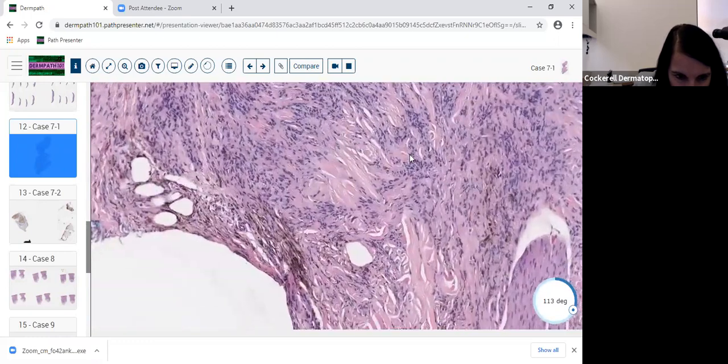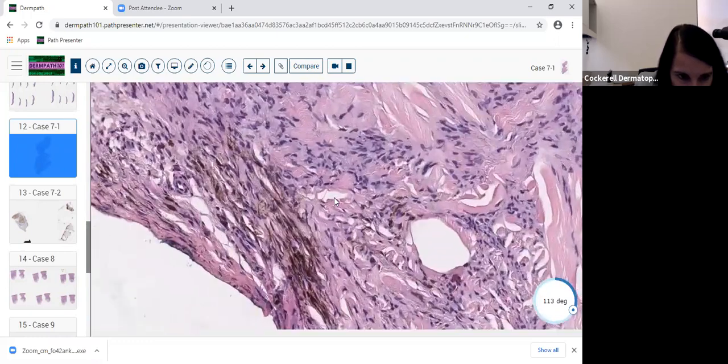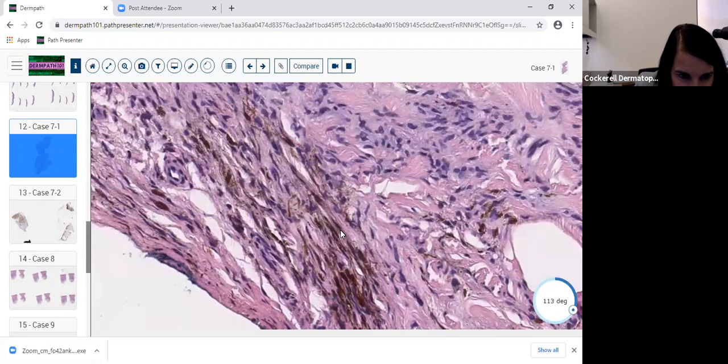You really wanna hone in on this area here. And right away you say, wait a minute, this isn't ink. This is pigment inside the cells. And you might wanna rack up and down your condenser if you're using a microscope to see if it's somewhat refractile. If it's somewhat refractile, you think more about hemosiderin. If it's not, it's more finely granular and not so globular, you think about melanin.